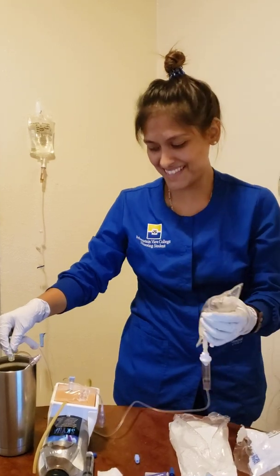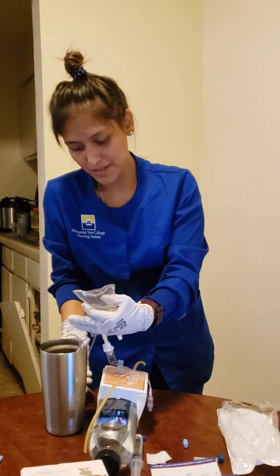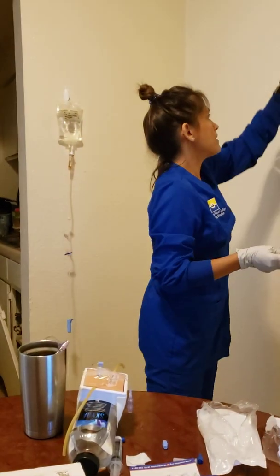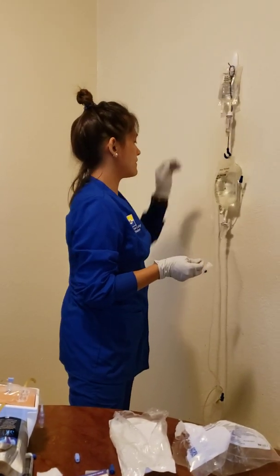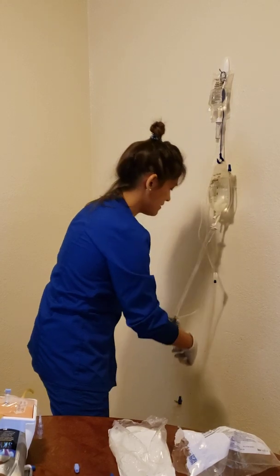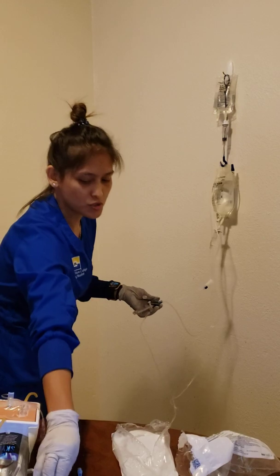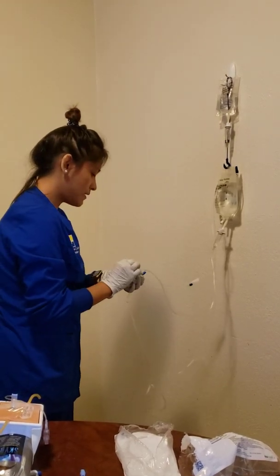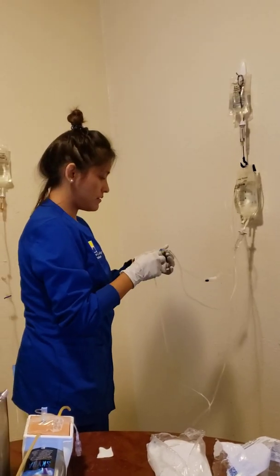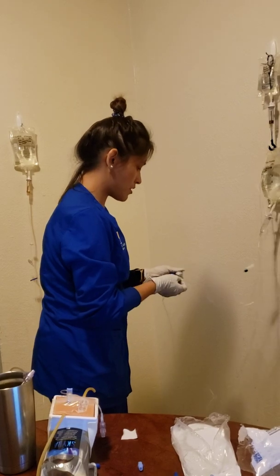And it is sterile. It is primed. So that's good. I just want to hang this one above. And I'm going to go ahead and connect it here, and make sure I grab my alcohol swab that is brand new. And I'm going to clean, hook it up, making sure everything is still clamped. Nothing is unclamped because I'm not ready to give it.